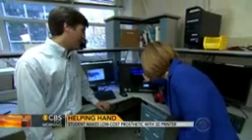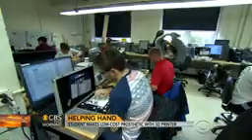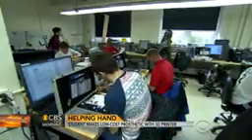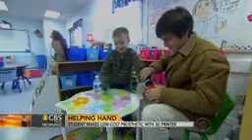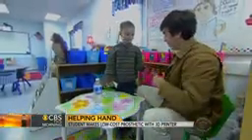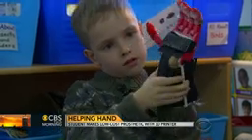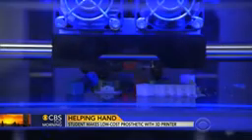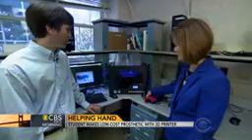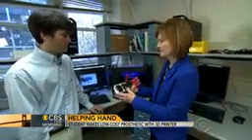Senior Jeff Powell studies biomedical engineering at the University of North Carolina at Chapel Hill. He took on the project after learning about Holden from one of his professors. He used instructions posted on the internet called the Cyborg Beast, then customized it. The 3D printer builds the parts in under 24 hours. And at the end, what you wind up with is this.